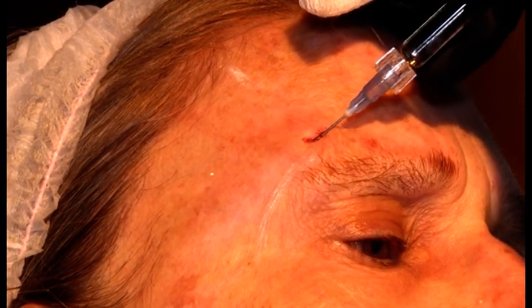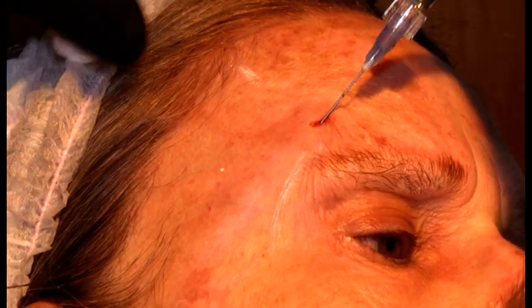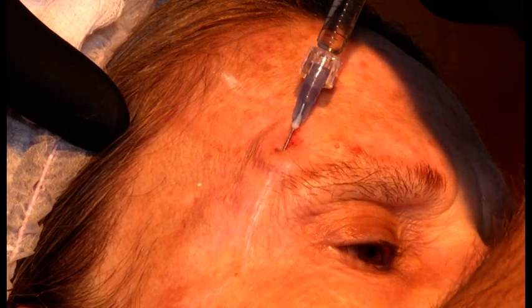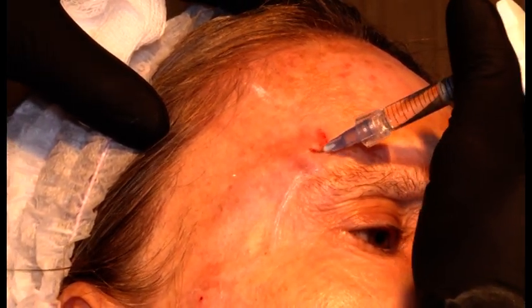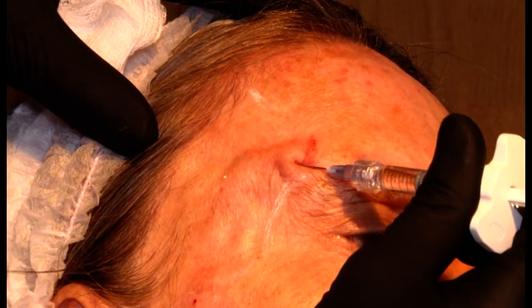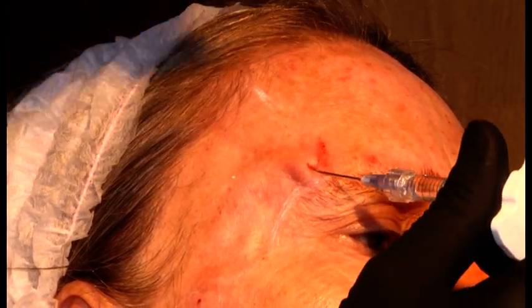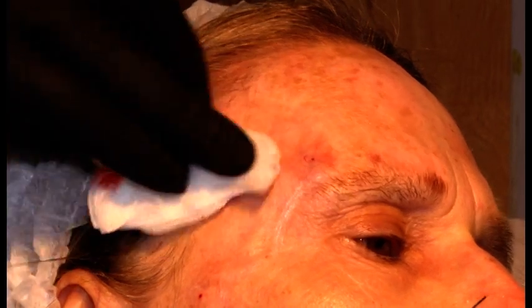I will start to inject a little bit of product. And I'm giving her retrograde linear threads. Now I've injected approximately 0.5 cc's. Let's see, exactly 0.5 cc's.